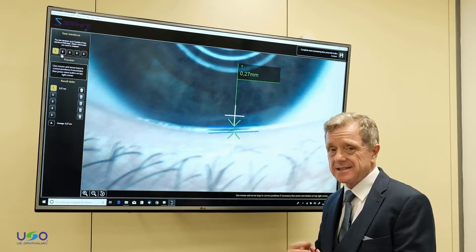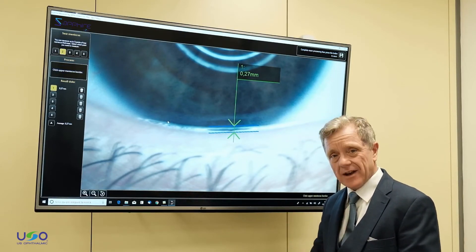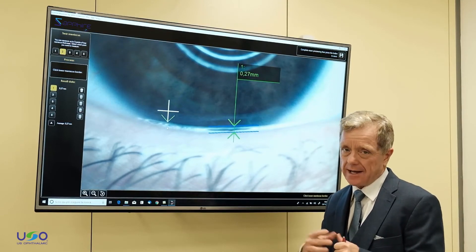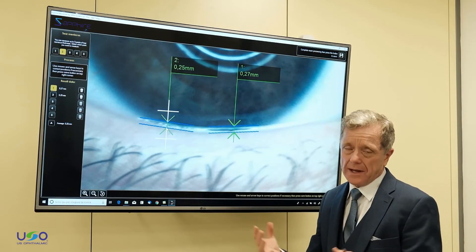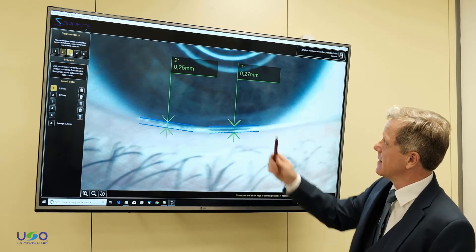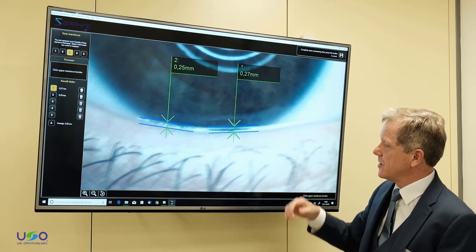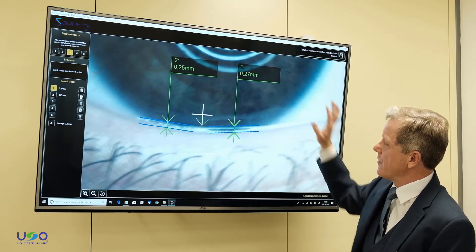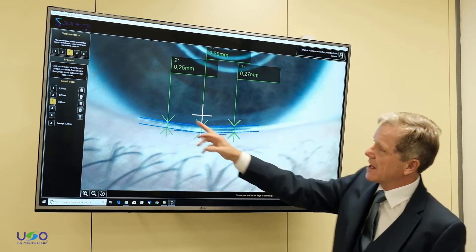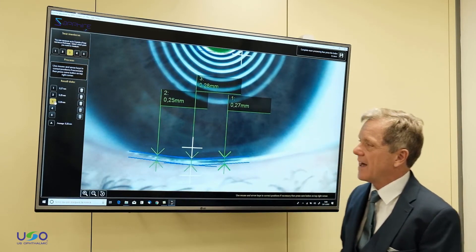The volume of the tears is essential in terms of determining whether or not we have an aqueous deficiency of the tears — that would be the aqueous deficient dry eye that we're talking about. You can see the numbers vary and you can select one of those images and one of those calculations from the screen and save that.